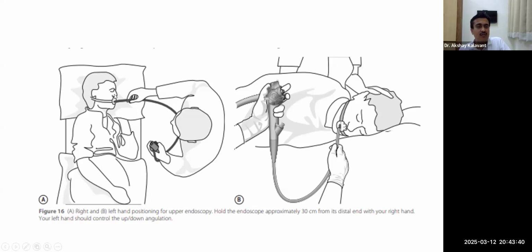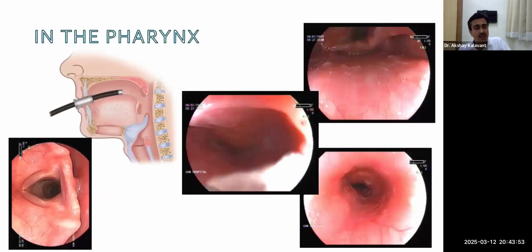Say, for example, if we have to take out an endoscopic foreign body from the esophagus, we might have to put the patient in the supine position. But by and large, the lateral is the very common position used for endoscopy. At the same time, we should get oriented to ourselves. The patient is not supine, so once we put the scope inside, the larynx will look something like this. First we have to get access into the esophagus, where we go into the hypopharynx over here.